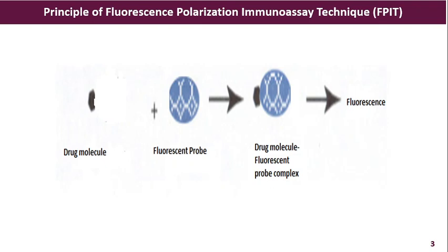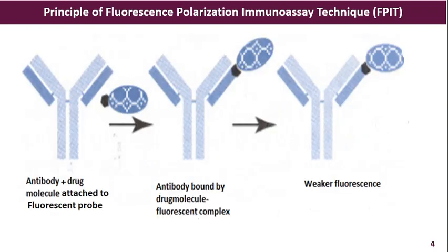It is observed that the polarization shown by the light when the drug molecule fluorescent probe complex comes in its path will be of a different angle compared to the polarization of the light shown by the antibody bound to the drug molecule fluorescent complex.